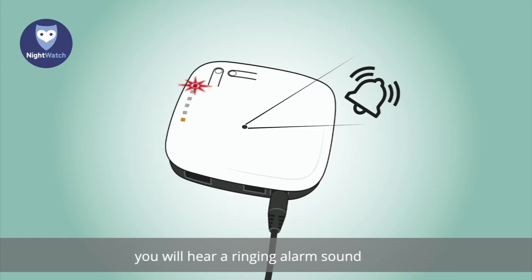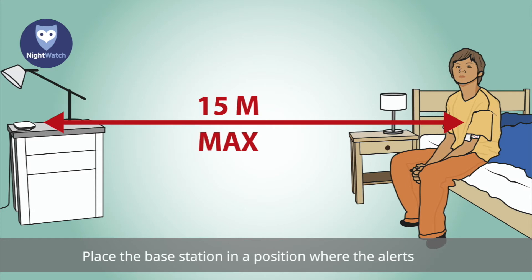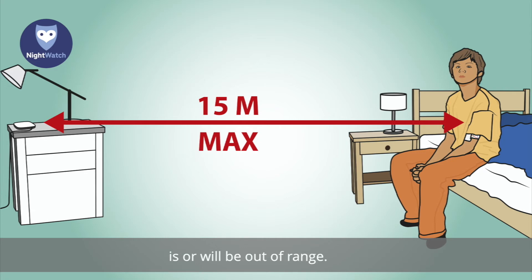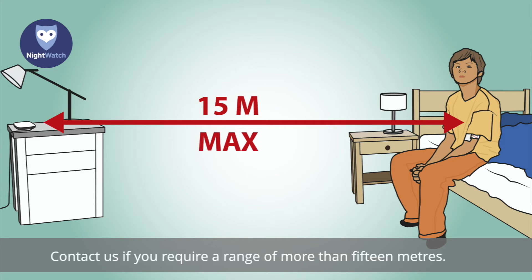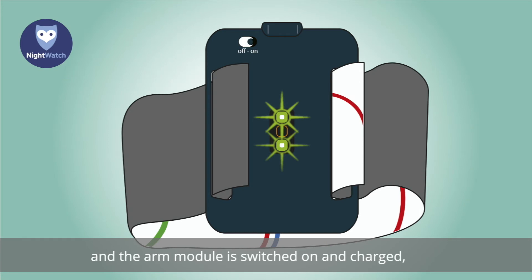When you press the buttons, you will hear a ringing alarm sound that is also heard if a possible epileptic seizure is detected. Place the base station in a position where alerts for a possible seizure can be heard. The distance between the base station and the arm module should not be more than 15 metres. The base station will sound an alert if the arm module is or will be out of range. Contact us if you require a range of more than 15 metres. As soon as the base station has started up and the arm module is switched on and charged, Nightwatch is ready for use.